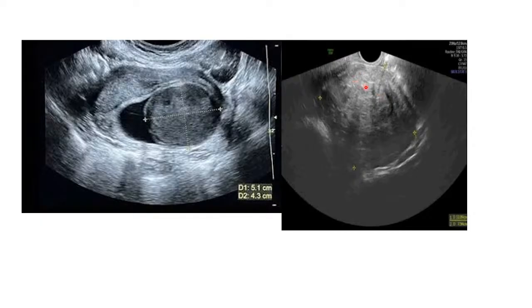the uterus. So you have to be careful, because they're also seeing the Venetian blinds. So this can be a fibroid or a differential, depending on the history, and if you do a TVS nicely, you will see it better.